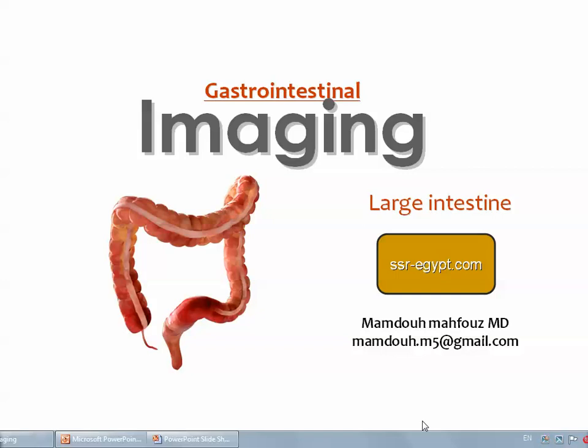Dear colleagues, we continue with gastrointestinal imaging, and this is the last lecture in the domain of GIT diagnosis. We have dealt before with the imaging of the esophagus, the stomach, and the small bowel. Now we are going to discuss the imaging of the large intestine or the colon.